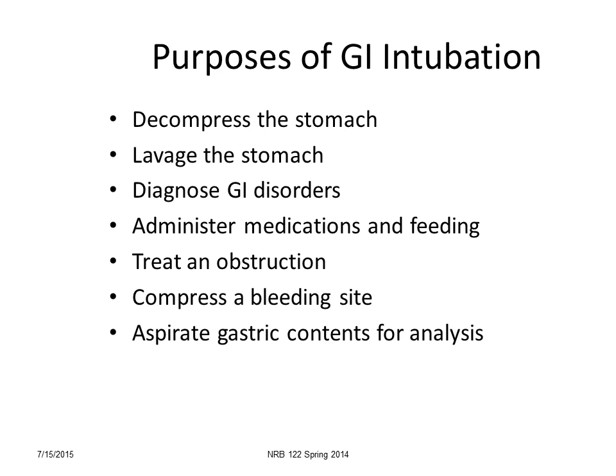So there's many reasons why we might want to use it, and believe it or not, nurses are primarily responsible for most GI tubes. Nurses put in most of the GI tubes. There are a few we do not, but once they're in, it's our job to maintain them, to manage them, and to troubleshoot them, and most importantly, to assess the patient frequently to make sure that they're not having complications.